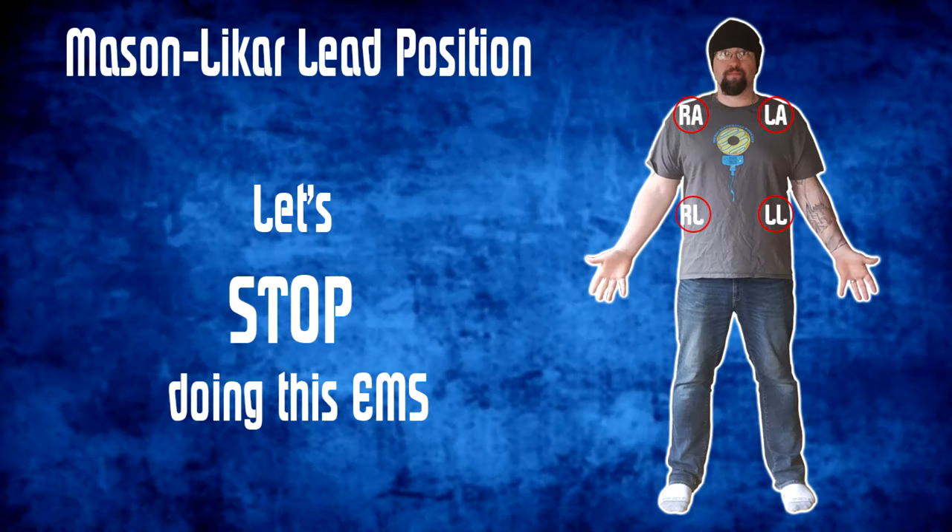For far too long, EMS providers have been utilizing a technique called the Mason-Likar lead position to place their leads on the body without knowing they're really doing it. This position takes the arm leads and places them on the meaty part of the front of the shoulder, and the leg leads and places those on the sides of the abdomen. This technique was designed specifically to be used in stress-induced exercise cardiac monitoring.